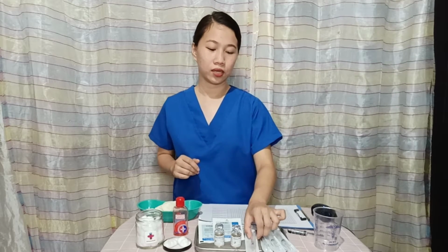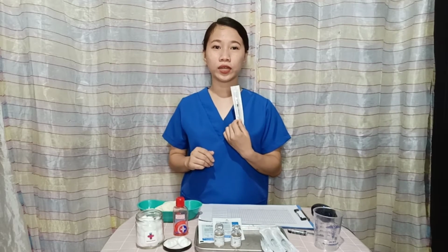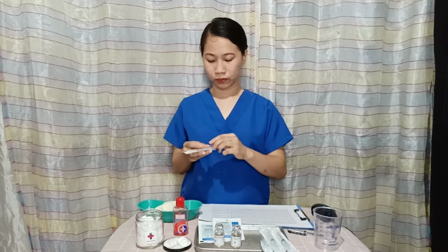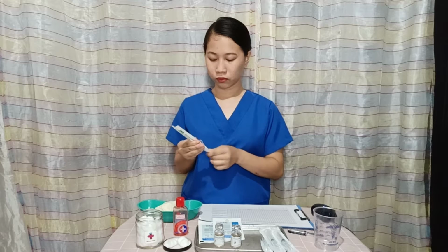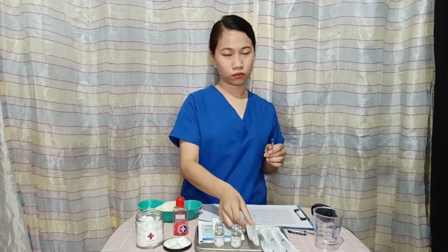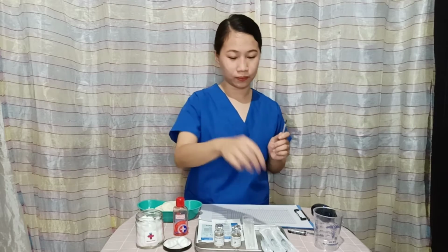First, we need to get the tuberculin syringe. Open the syringe sterile package. This is the tuberculin syringe. Let's open it. Then, connect the aspirating needle.